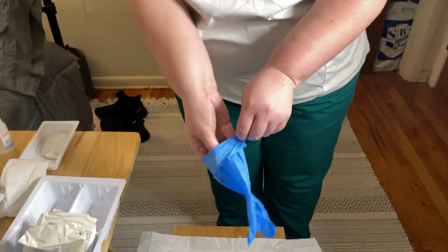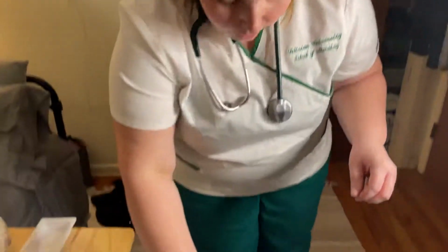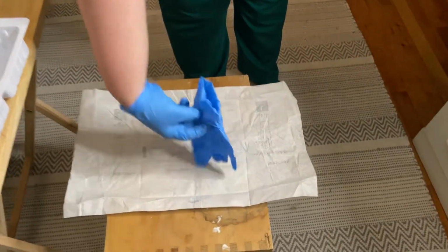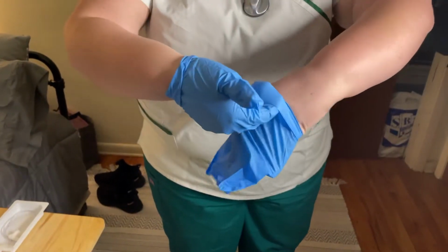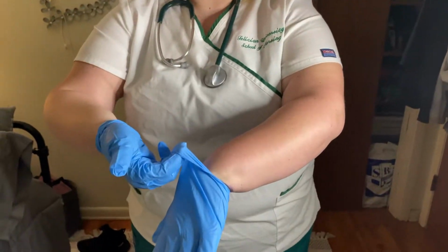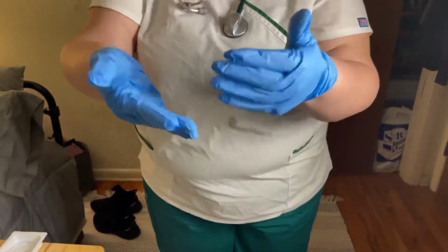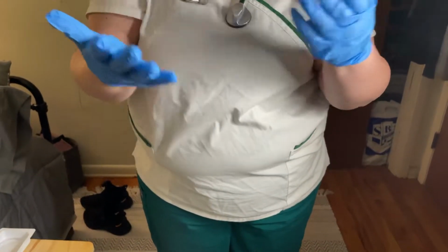I'm going to place my right hand in, and then I'm going to use my sterile fingers to go under the cuff of the second pair of gloves, and I'm going to put my second hand in. I'm going to make sure that I don't touch my skin at all with the sterile fingers. Then I'm going to go under the cuff of this one and just pull it up to make sure my gloves are fully covering my hands.